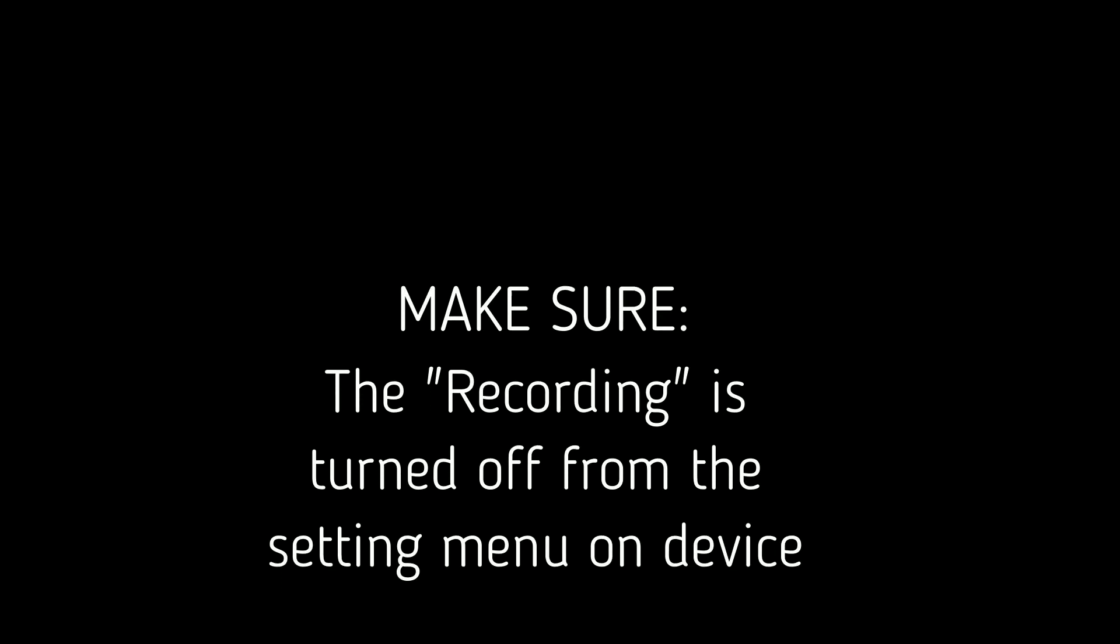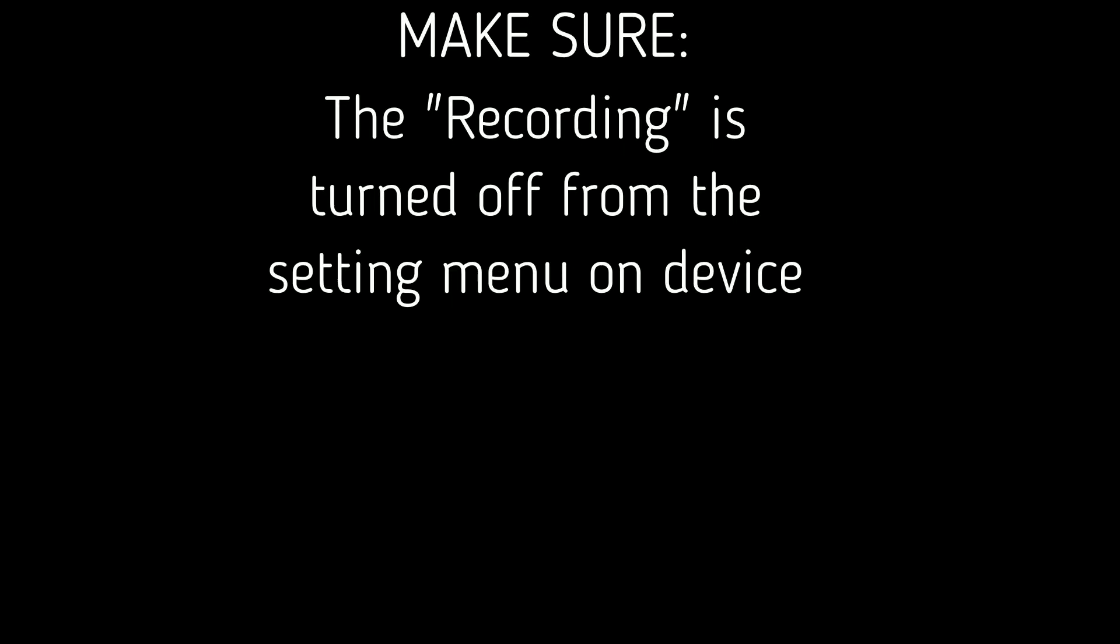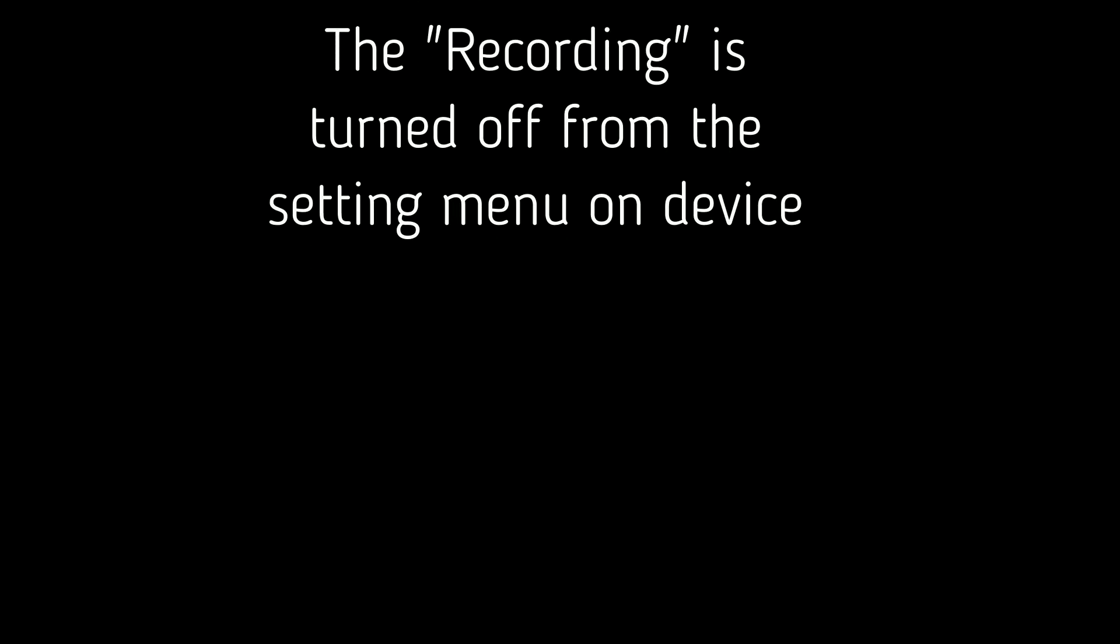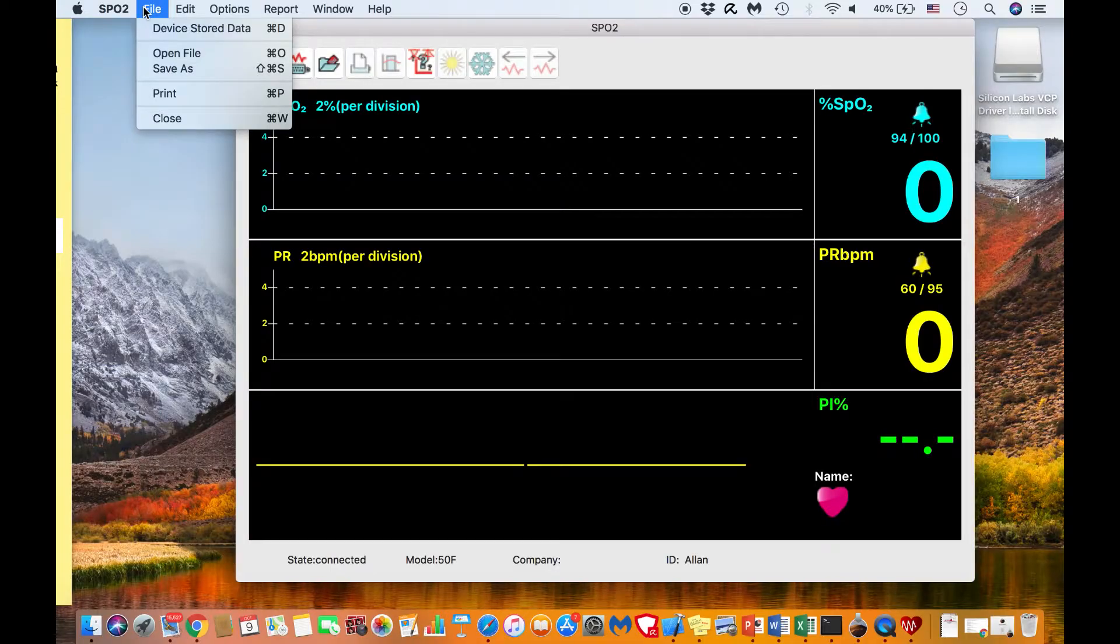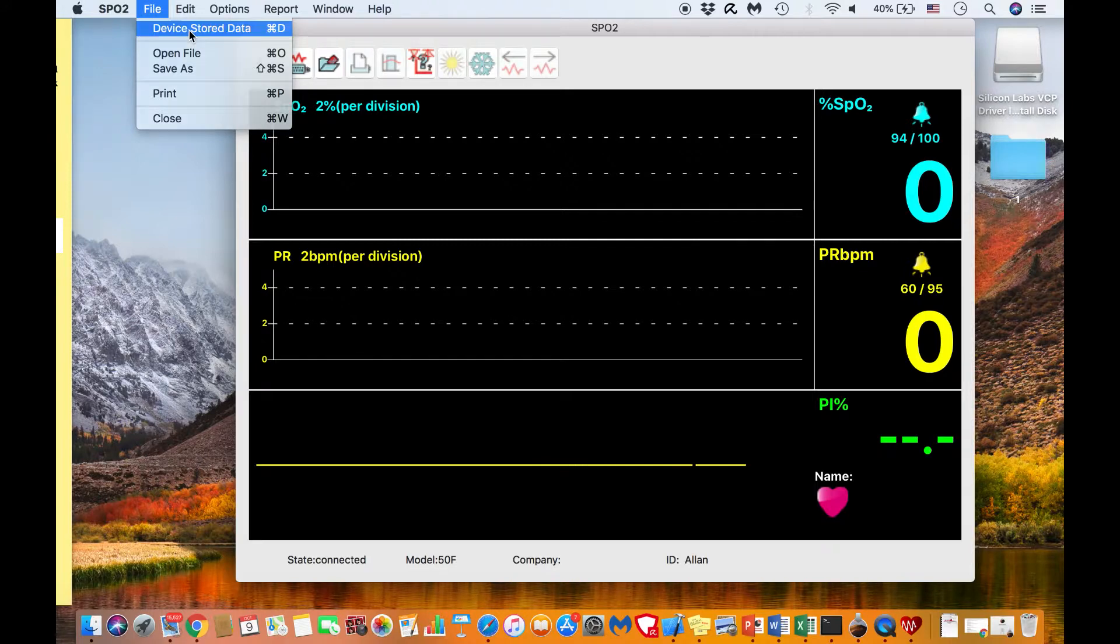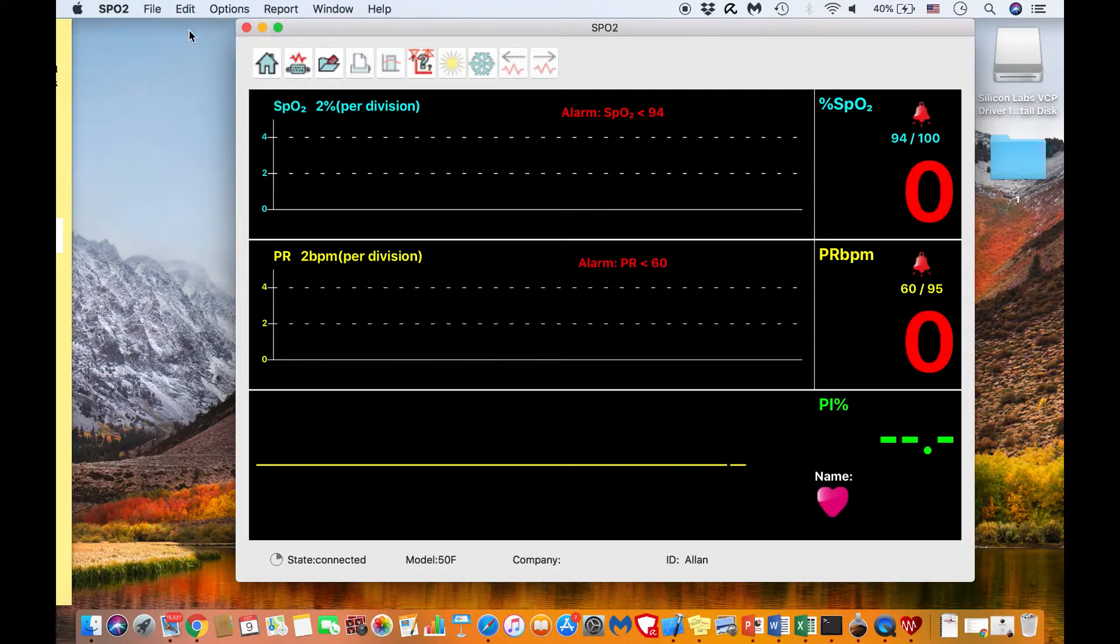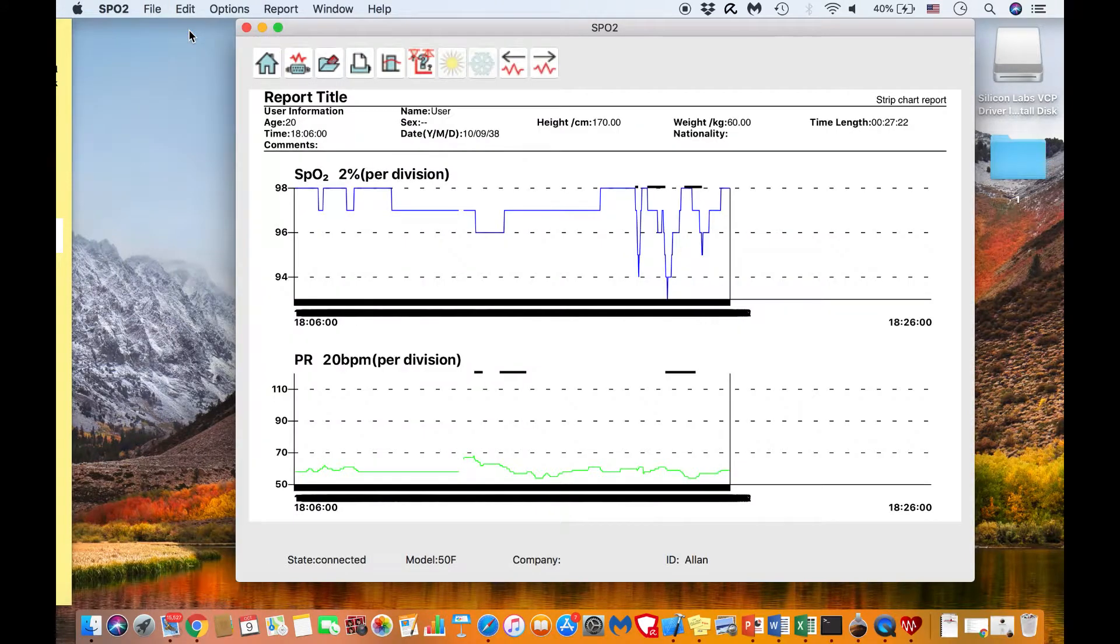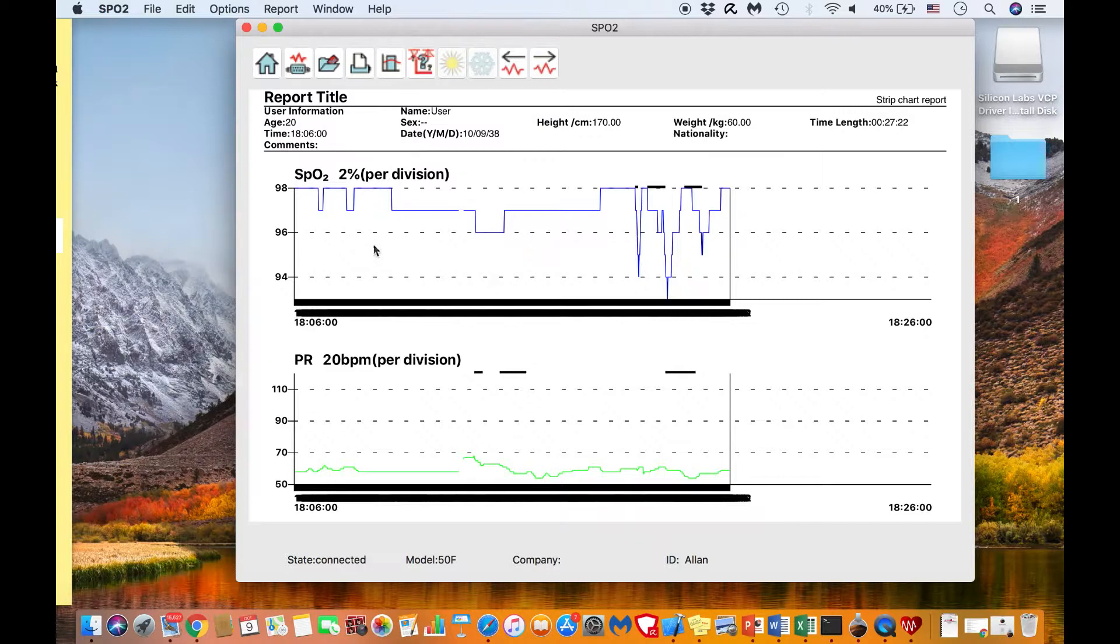If you have data recorded on your ToronTek B400, make sure you have stopped recording from the Oximeter main menu setting. Go to File from main menu and select Device Stored Data. You will see your report on screen.